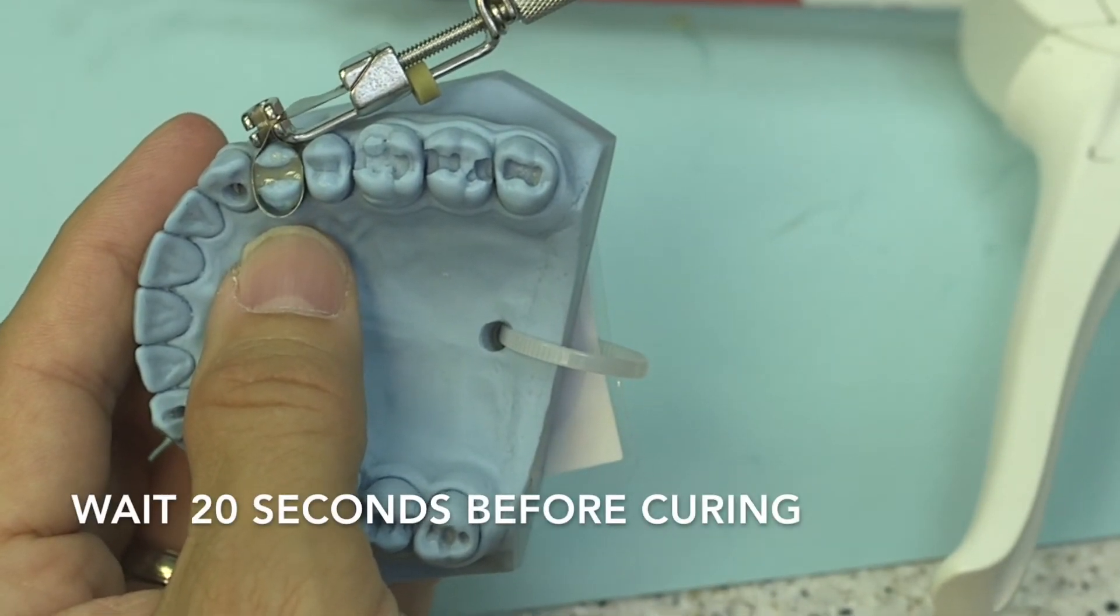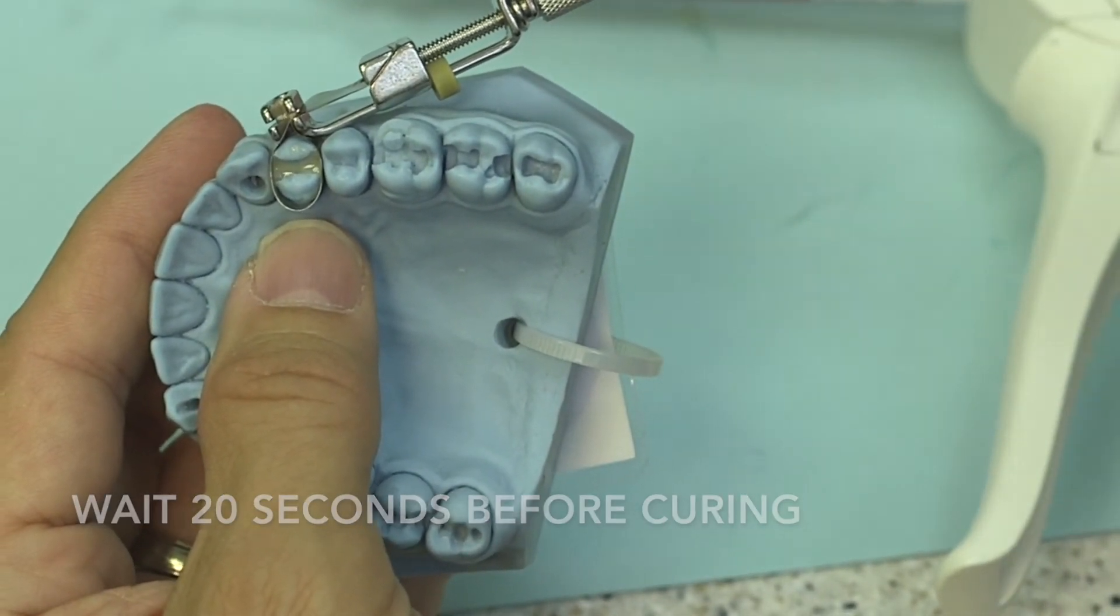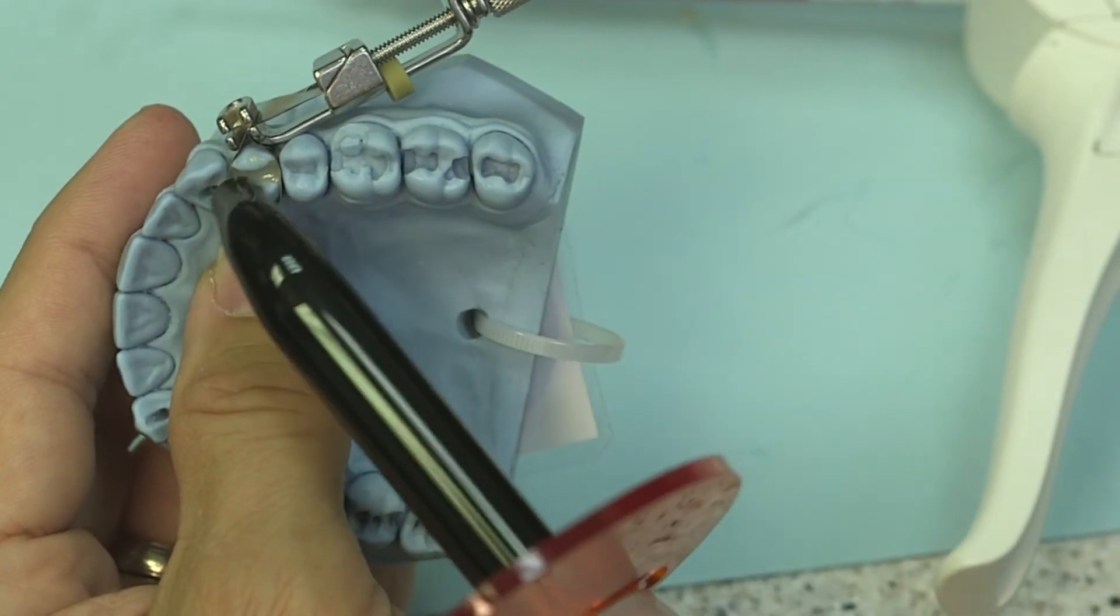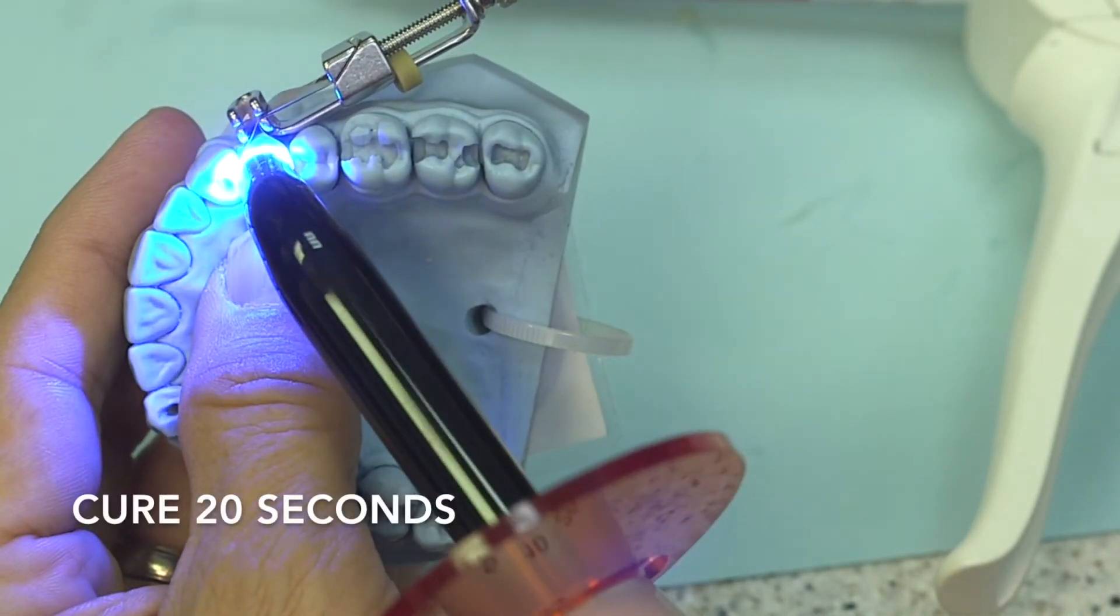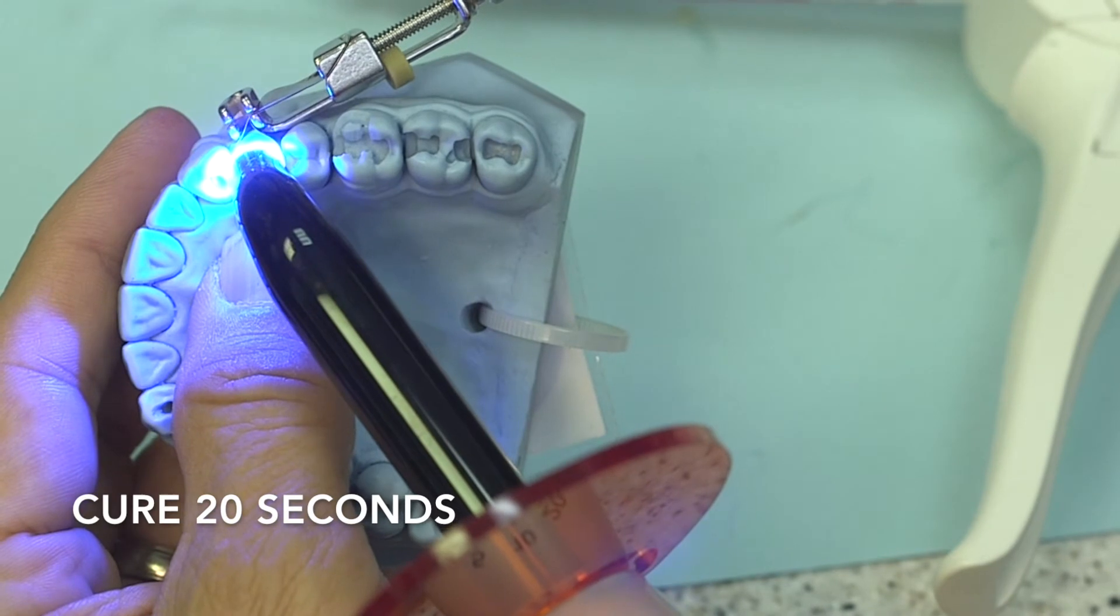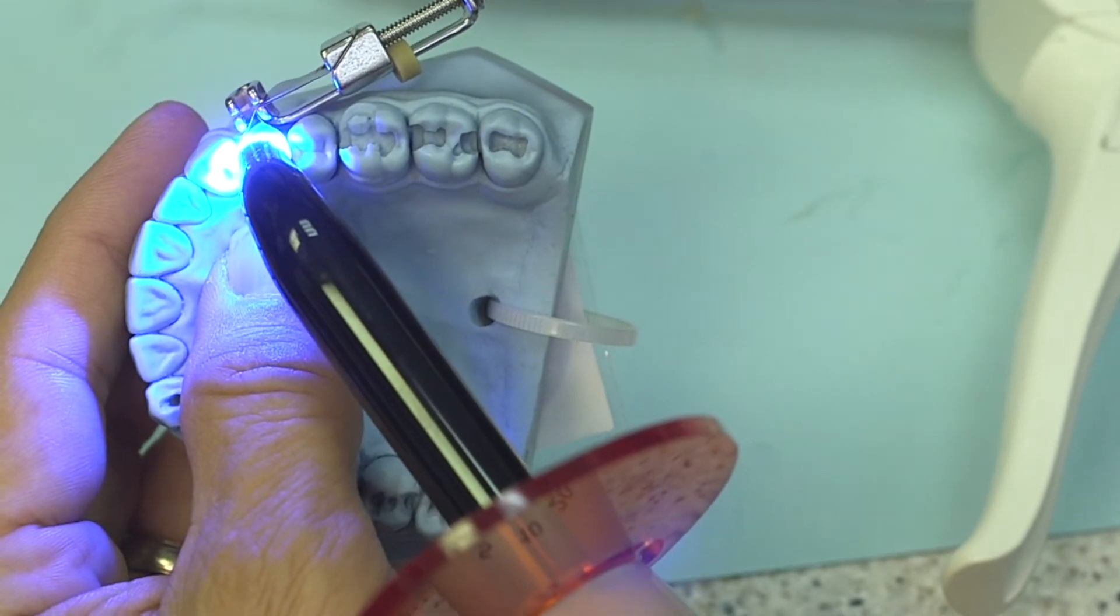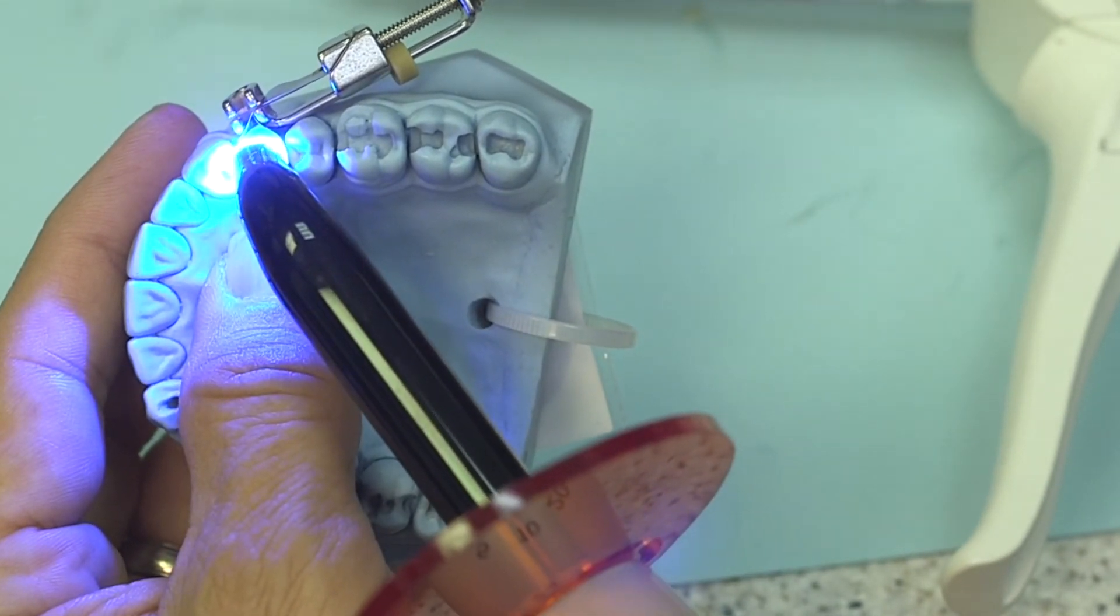Notice I'm not curing it. I'm going to wait that 20 seconds before I do, and then once that's ready I then cure. Again, another 20 seconds under regular intensity of your LED light.